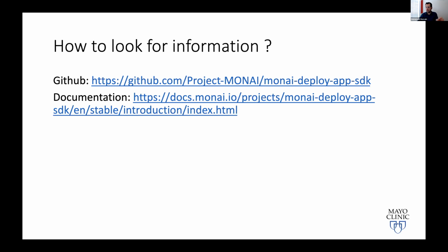How's it going? Yeah, you were good for a demo, and then we'll take questions after, Vikash, when you're completely done, because we'll also be demonstrating the viewer of the OHIF part. So you have about maybe 3 minutes, and you can demo the viewer then. That is more important, actually. Okay, I'll stop sharing. Let me share my screen.